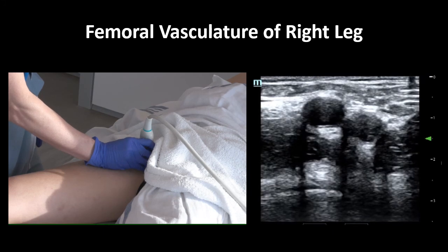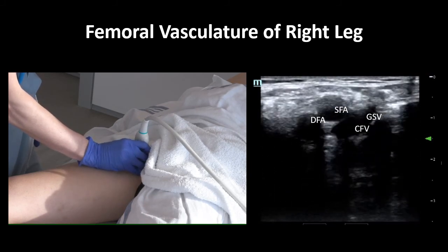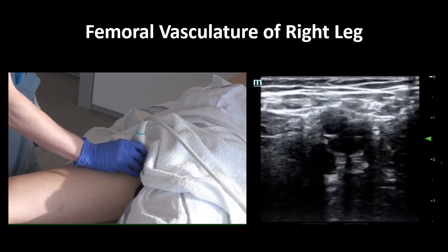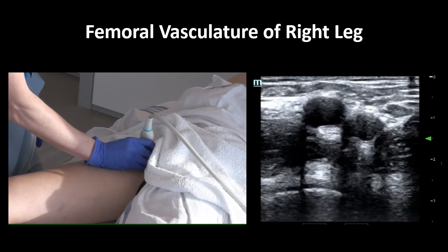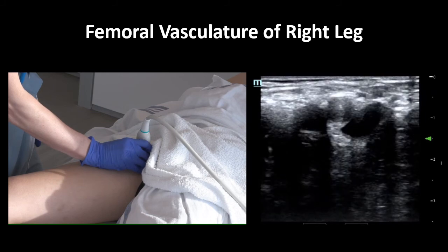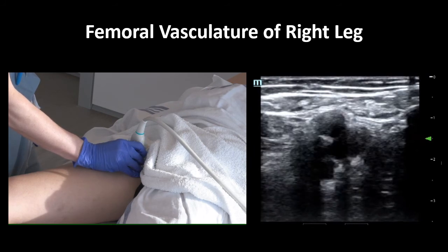As we move inferiorly, we see the bifurcation of the common femoral artery, and right after that, the great saphenous vein splits off the common femoral vein and moves medially. Then you can see the common femoral vein split into the deep femoral vein and the femoral vein. Now watch again, this time focusing on the pane on the left. Notice what small hand movements are needed to allow you to see the entire relevant femoral anatomy, and note that the hand is anchored to the patient to help control the sliding of the probe.